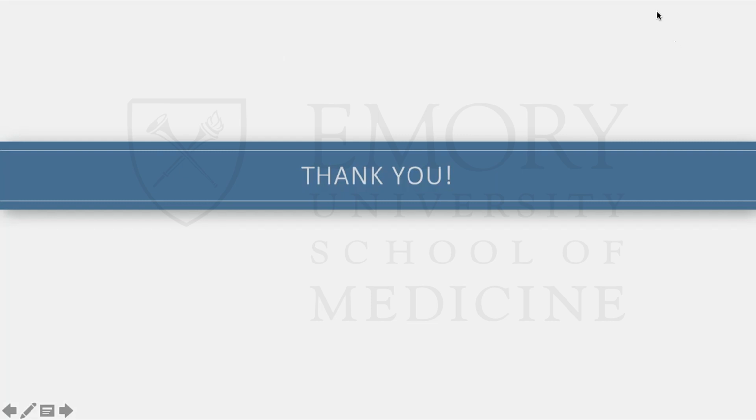Yeah, Colin, go ahead. No, you go ahead, Robbie. Yeah, my sense is it was probably more about simplifying sonographers' lives. But if someone had a normal E/A ratio and then during Valsalva their E wave dropped significantly and they developed an E/A less than 1, that would suggest grade 2 diastolic dysfunction versus someone with normal diastolic function, whose E/A ratio would remain greater than 1. We used to do that in the past, but I think it was more of a time saver. And it was technically difficult to get good images while someone was Valsalving at times.